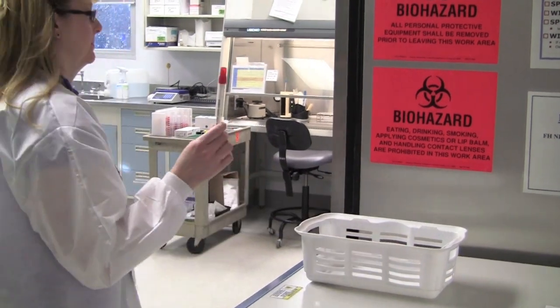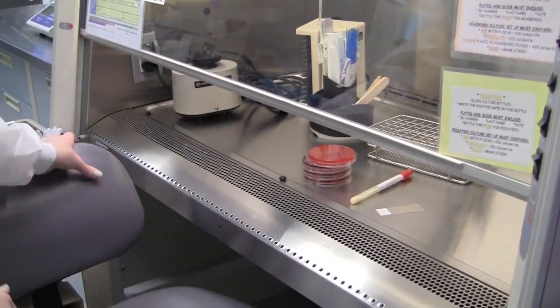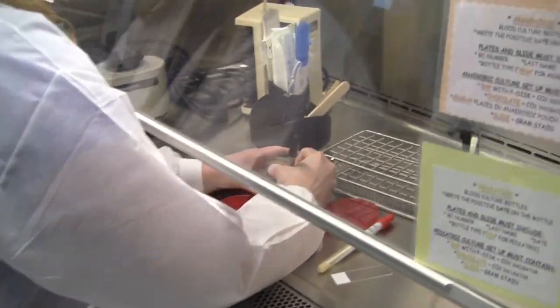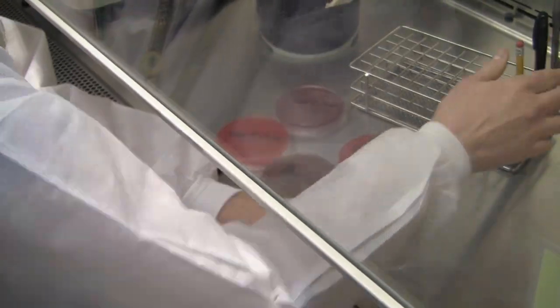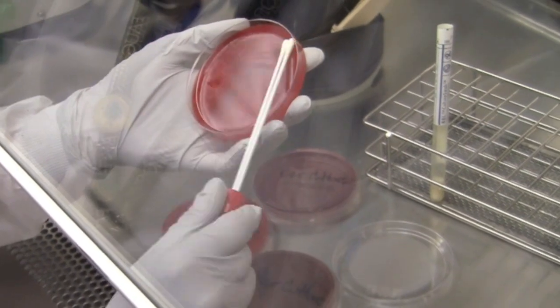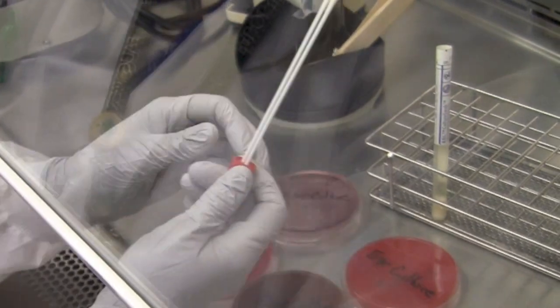The ear culture swab is moved under a special ventilated hood to prevent contamination. After labeling, the swab is streaked onto 4 different agar plates as well as a slide. Each plate contains a different type of medium or food which allows for differentiation of what germ may be present as it grows.